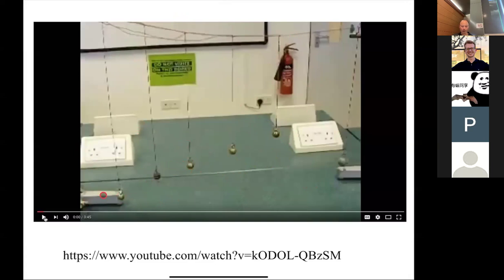So this is like a gradient, because these pendulums are going to swing at different frequencies. And now this is going to be the analogy to the RF excitation pulse. We're going to start this one swinging. It has a certain length, so it's going to swing at a certain frequency. That's going to be like my RF pulse. So you're going to look at this movie and keep an eye on when this starts moving, which of these starts swinging. Hopefully this plays.